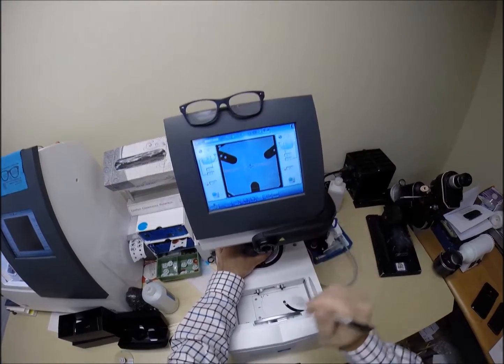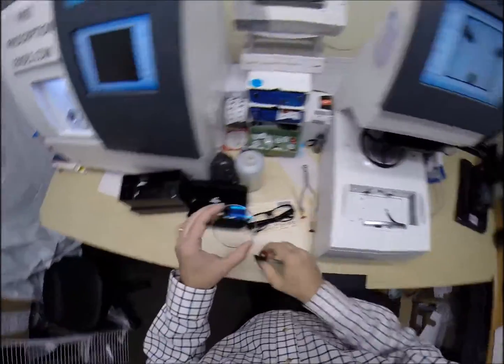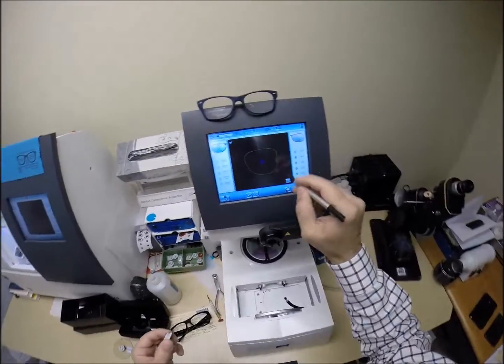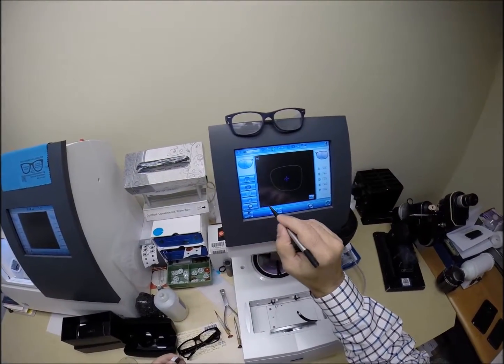We are good to go. Hit that button. Oh, look at me. I forgot to put the sticker on the left side. Pull the paper away to make the black side sticky. Pull up the shape again.